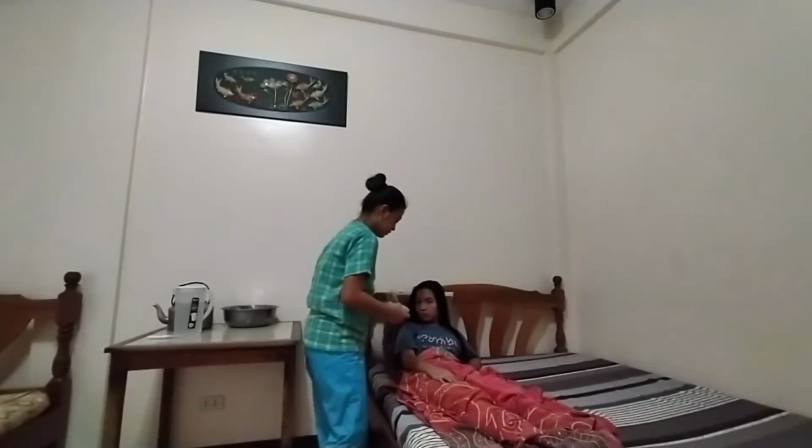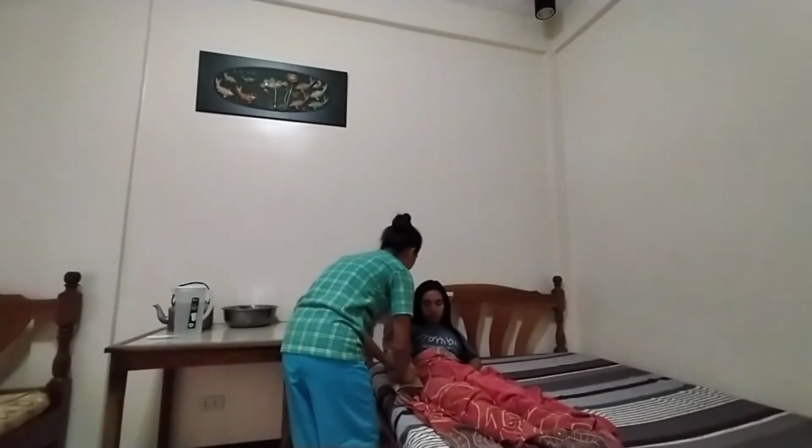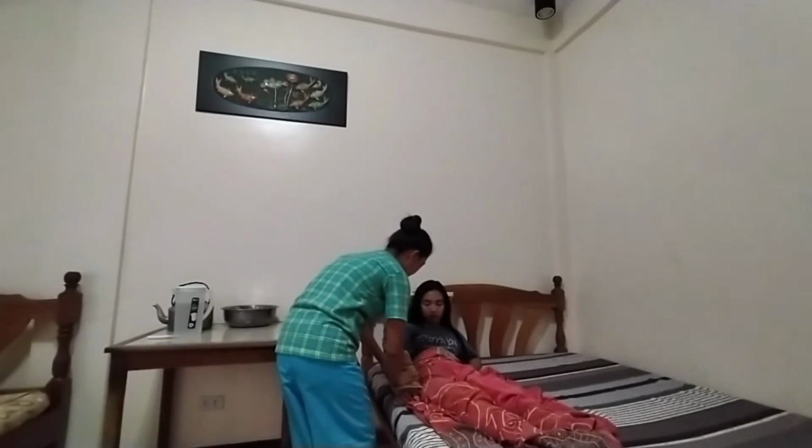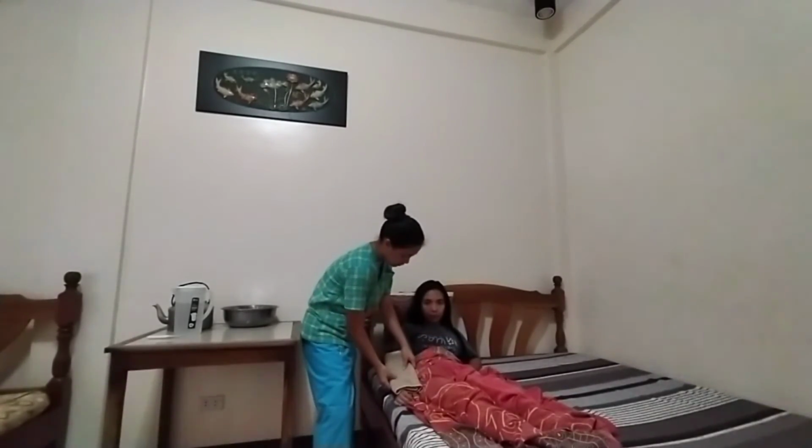So I'm going to use this hot water bag on the patient. Okay lang po ba yung init ng hot water bag, ma'am? Then, I'm going to remove it after 5 minutes. Thank you, ma'am. Then, empty the bag after use. Dry it well inside and outside. Let some air in and keep it in a cool, dry place. Flattening the hanging bag will prevent the inner surfaces from adhering to each other.